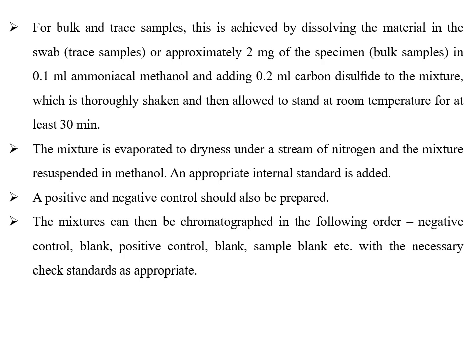The mixture is thoroughly shaken and then allowed to stand at room temperature for at least 30 minutes.